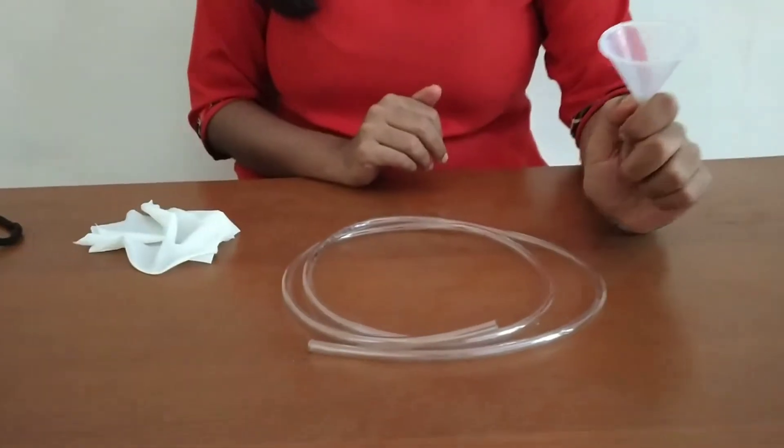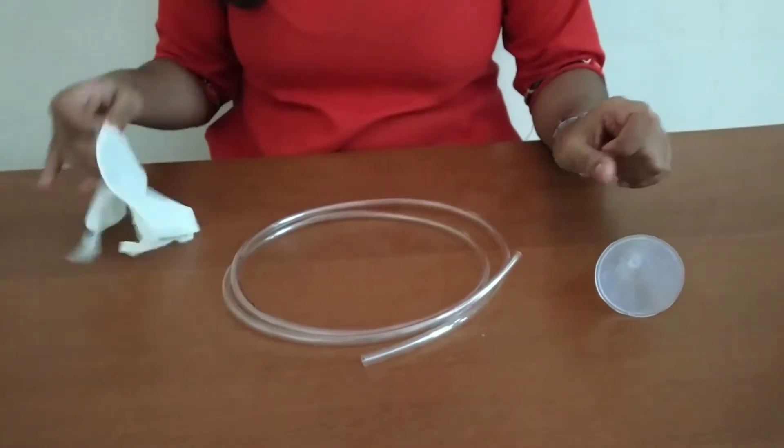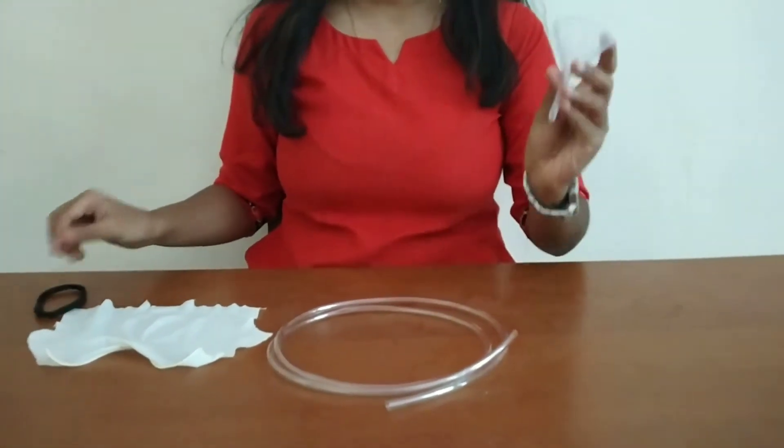For that we are going to need a funnel, a tube, a balloon which is torn, and a rubber band.